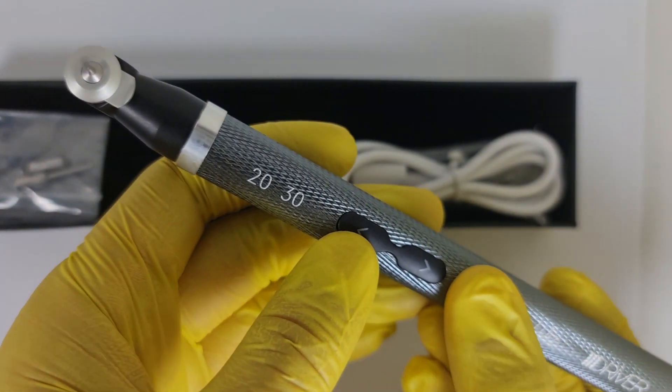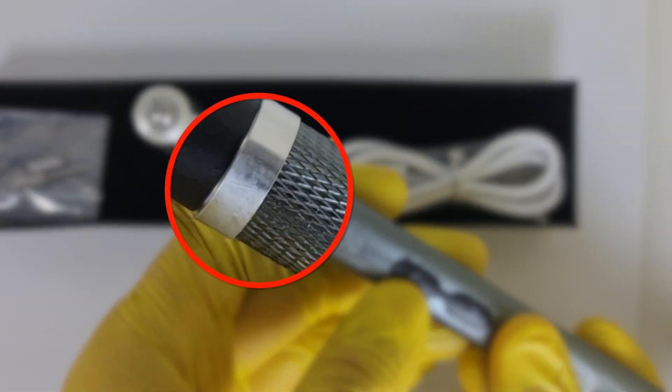The LED ring is the indication of torque you are working in. If it blinks once you're on 20, if it blinks twice you're on 30 newton centimeters.